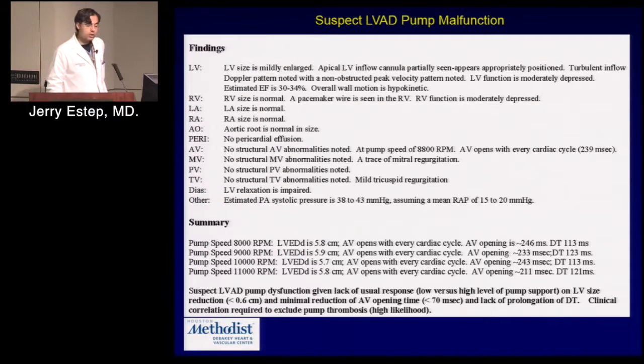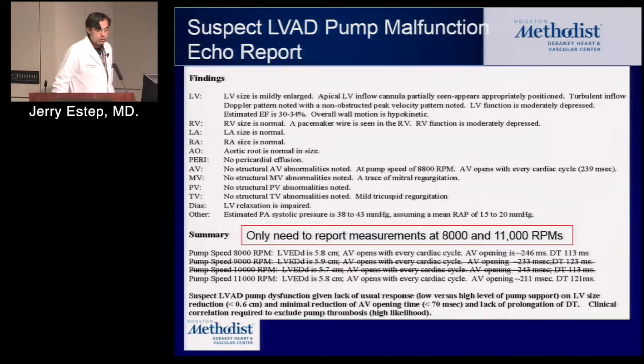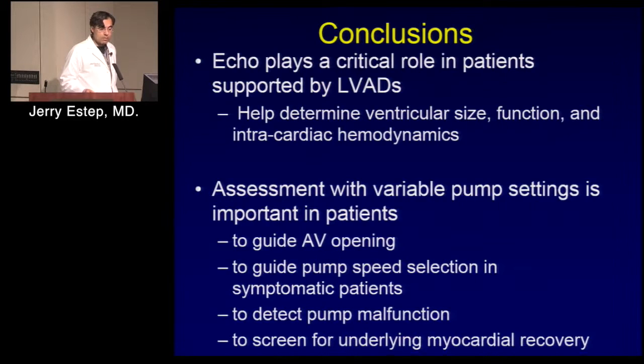So for the pump malfunction protocol, they're going to do baseline, and we've modified this. They're going to do low and high. Let me give you the modified report. Really I'm interested in the LV size: what's the LV size reduction, low versus high? What's the aortic valve opening? You could just qualify it. We may go back and measure it, and the mitral valve here. This gives us a good hint if the pump's working or not. So that would be a nice pump malfunction report.